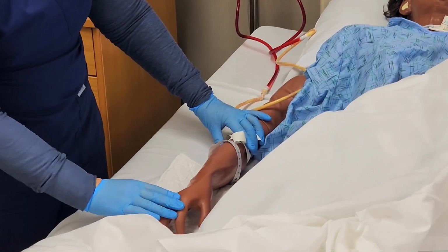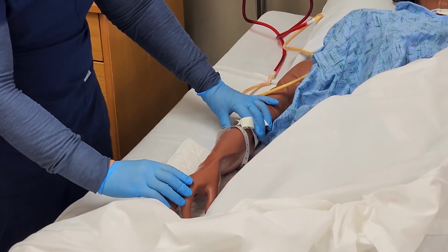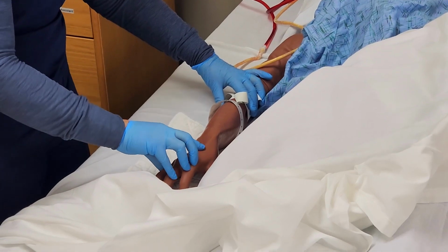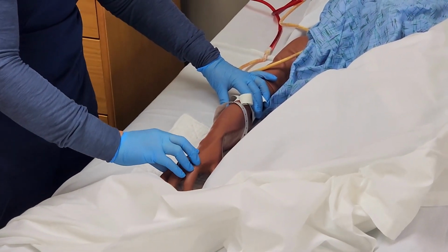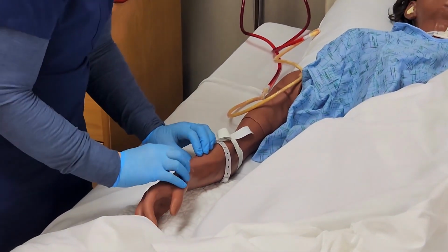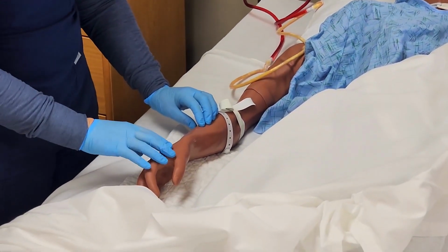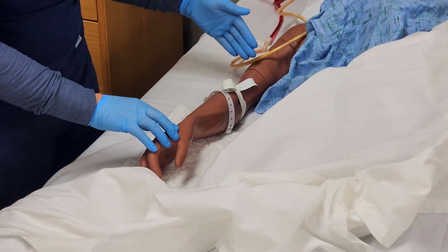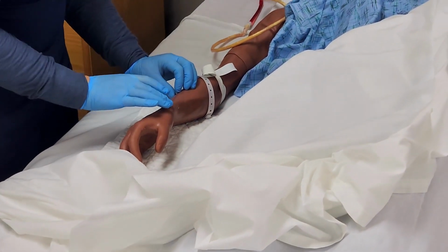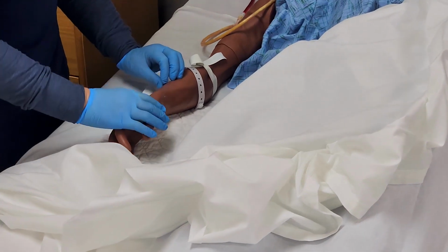The veins in the hand look fairly good. They also have, I can feel this one here has a few bumps that might be a valve. So I'm going to go up a little bit further, because a lot of times you want to start more distal, because if you're unsuccessful, you might have to keep going a little bit up in the arm. So I'm going to go ahead and feel this vein here.